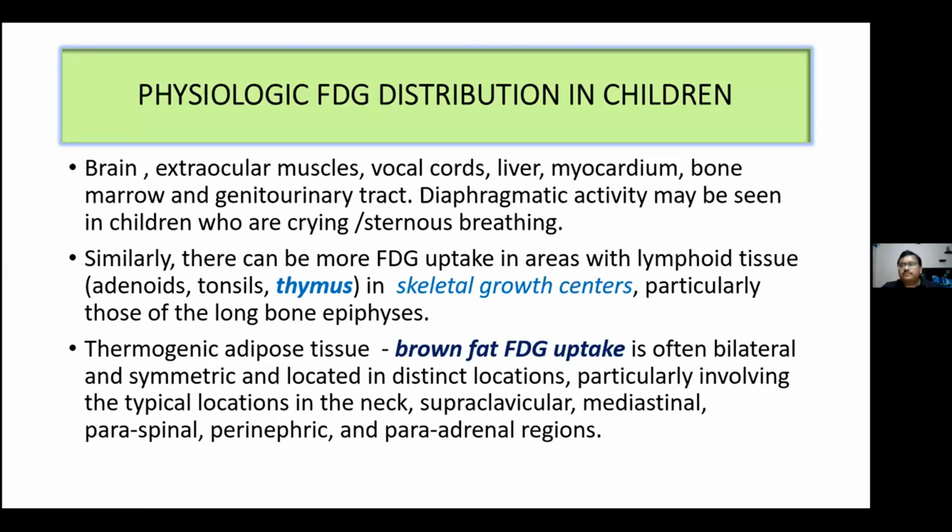way of putting these patients into a scan. They will either give diazepam, or heat the room, or schedule it in such a way that the brown fat uptake is minimal. The brown fat uptake is more in cold weather. It is more in children, and more when the child is shivering. So brown fat uptake can be minimized by use of diazepam. It can be minimized by propranolol.